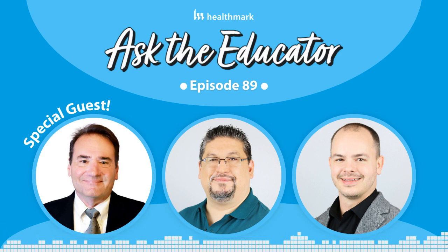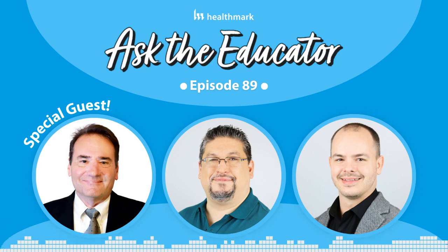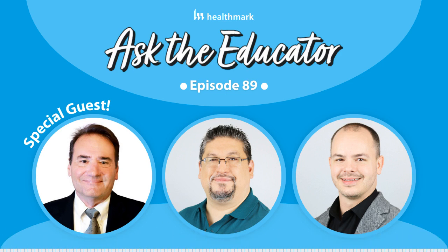Now, a big player in that is also testing labs, because some device manufacturers actually have the ability to validate in-house. I'm jealous of them because they spend a lot of money and they have a lot of capability. But most device manufacturers, even the ones that can do some testing in-house, ultimately will go to an independent testing lab because they want the stamp of independence, right? And testing labs are experts in doing this kind of testing and getting results and reports that the FDA will recognize and review. And so those are the two big groups that ST98 is aimed at.